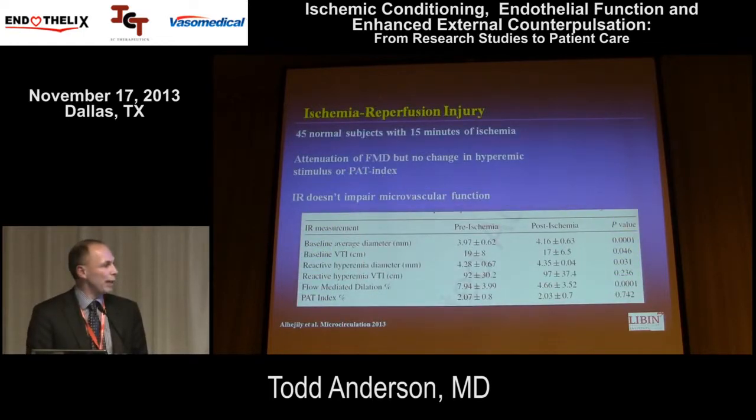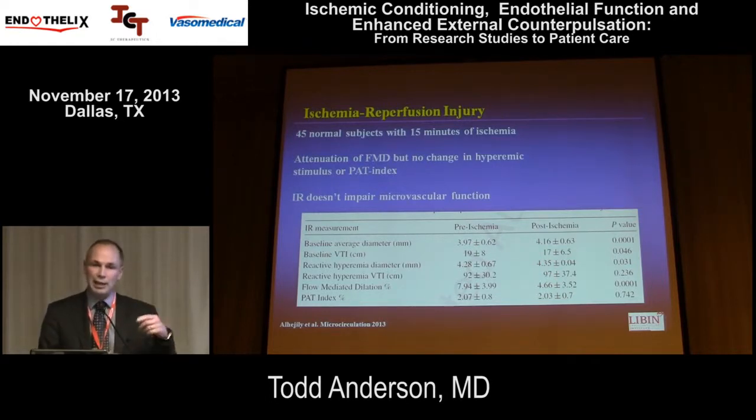We did one study in this domain that we've just published in the last few months. My interest was in PAT to see if ischemia reperfusion attenuated the PAT signal. So what we did is we took 45 healthy subjects with 15 minutes of ischemia and looked at flow-mediated dilatation, the hyperemic stimulus, and also the PAT index. And what we found is that flow-mediated dilatation decreased from 8% down to 4%, but there was no attenuation of PAT index and there was no attenuation of the VTI or the hyperemic stimulus. So the microvasculature was intact, but the conduit vessel response was attenuated with 15 minutes of ischemia.